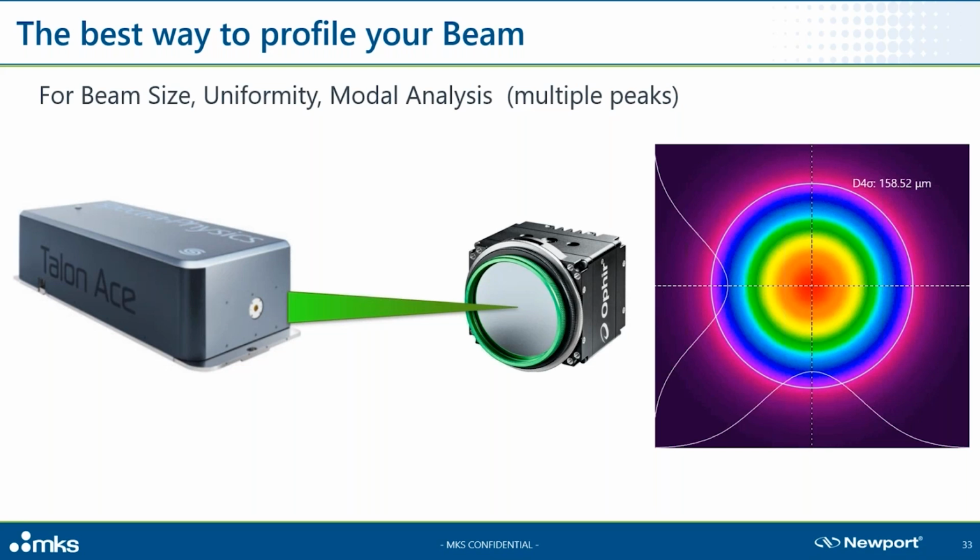But wait, Nathan, didn't you just say don't measure your beam at the waist because you can damage your sensor? Even though average power will be the same anywhere along the beam path, we learned that power density is highest at the waist. So yes, I'm glad you're paying attention. But if you're trying to selectively target a certain area, heat a tumor for example, you need to see exactly where your beam hits focus and what your beam is doing at focus, the narrowest point along the beam.